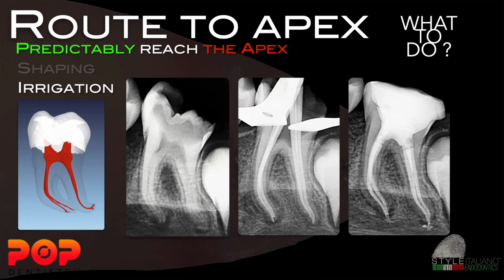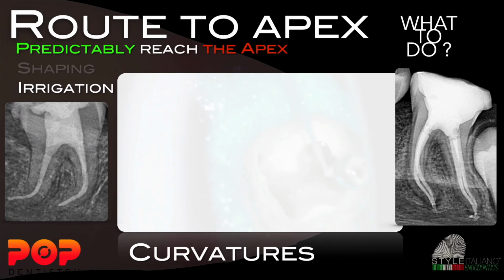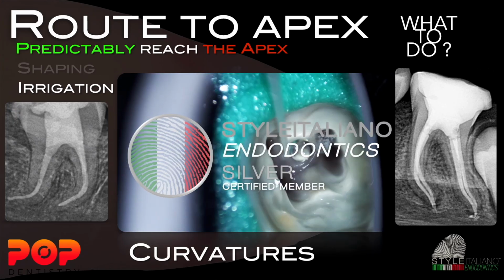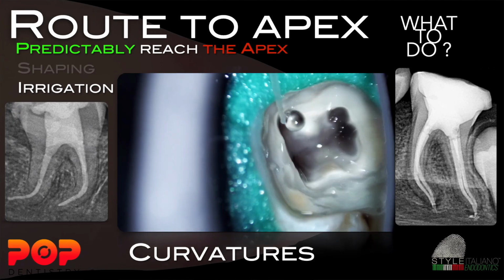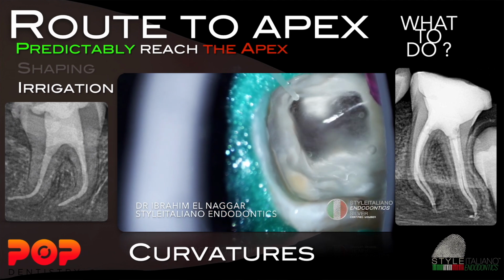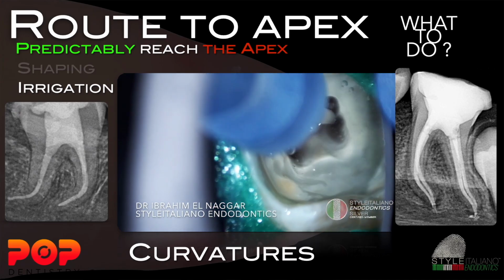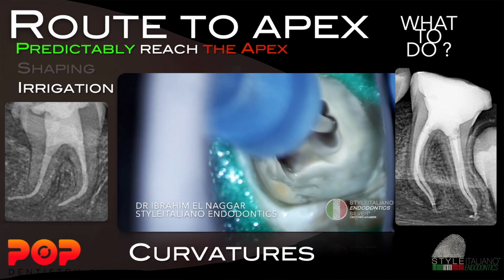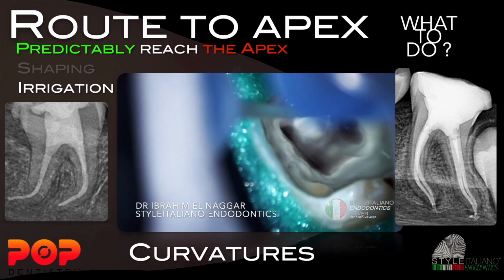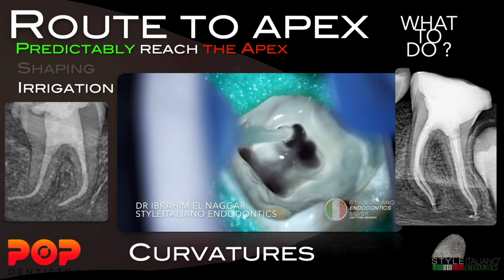So in this case, I shifted from the normal metal needle to another one, which is a polymeric needle. I just want to deliver my irrigant till the apical part of the root without any debris, without any blockage, so it will follow the anatomy. Doing this will bring us to the apex. Thank you.